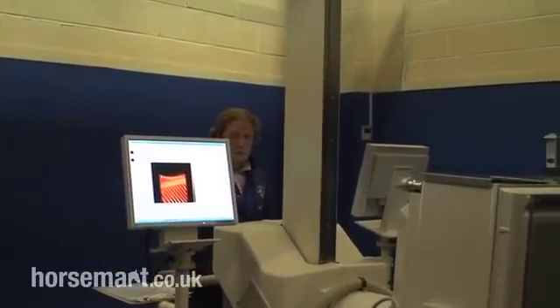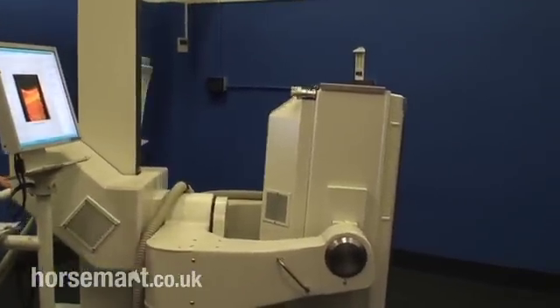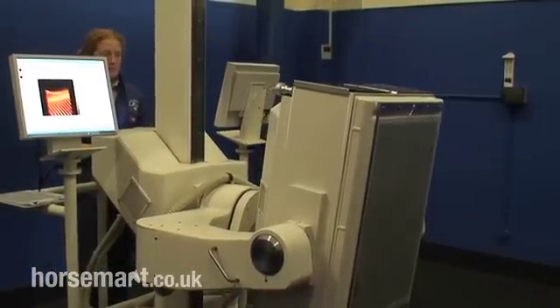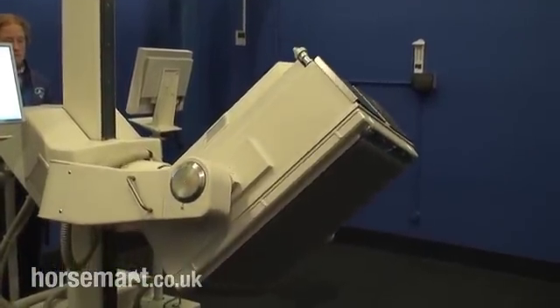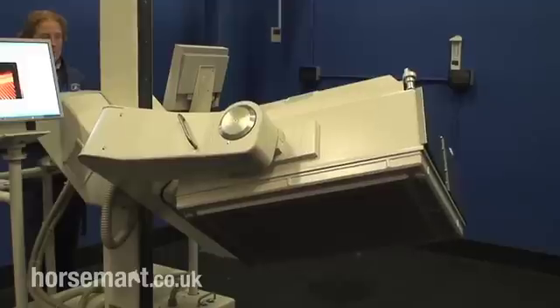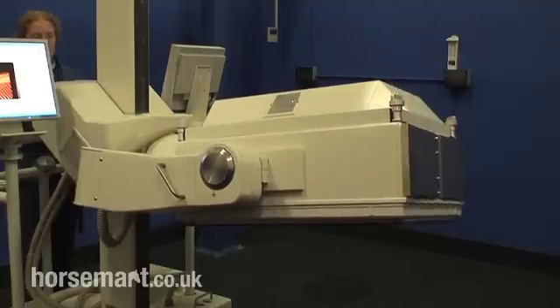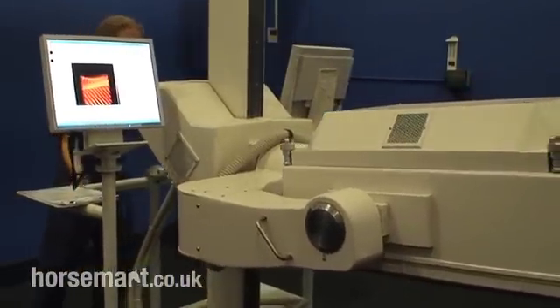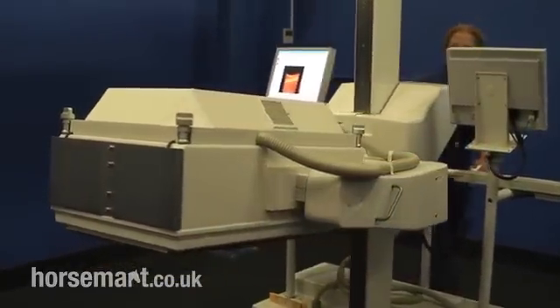Becky will show us how this machine can be operated. The horse is in here for two or three hours, sedated, and this machine moves around the horse. A sedated horse will stand quietly and then the camera can be moved around the animal — up and down, over the top — to pick up every area of interest. We may just be scanning one hind leg or one foreleg, both hind legs, the pelvis, the back, the neck, or the head. It may be that we need to scan the whole horse. By moving this machine around the horse, raising the head up and down, tilting the angle, we can pick up all the radiation emitted from the animal, and then the computer produces an image for us.